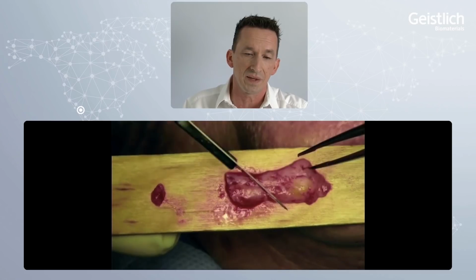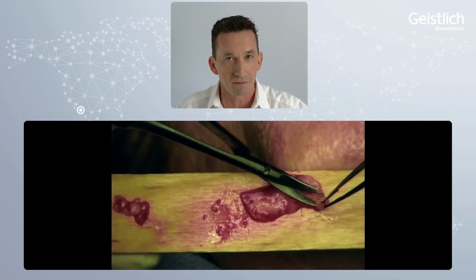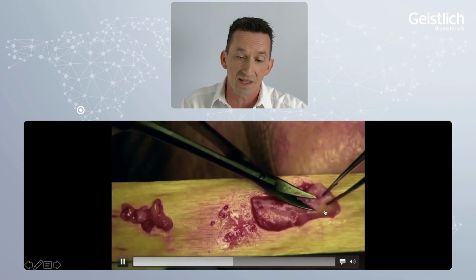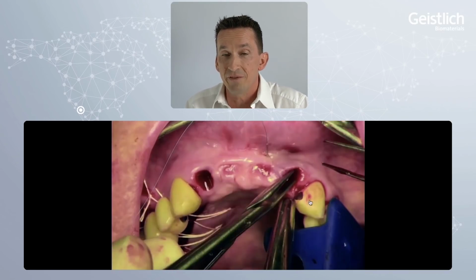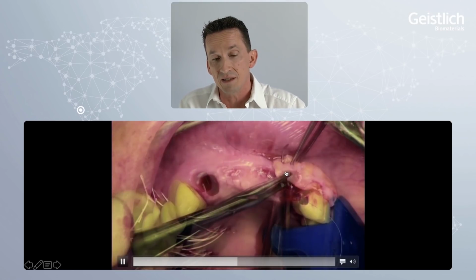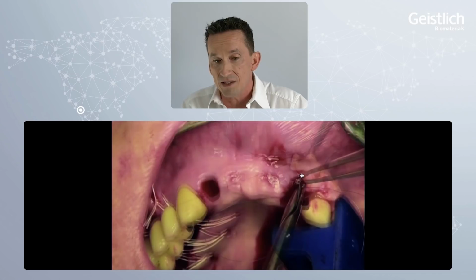In her left pouch, she got a connective tissue graft. As you see here, we have to take off the fatty part and remove the glands. Then, of course, suturing now is very easy. You only have to go through the pocket, out the alveolar socket, two times through the connective tissue graft, and back into the pocket again.